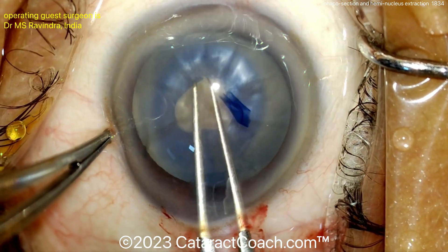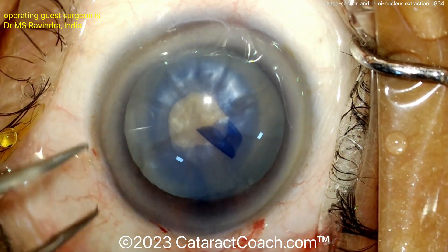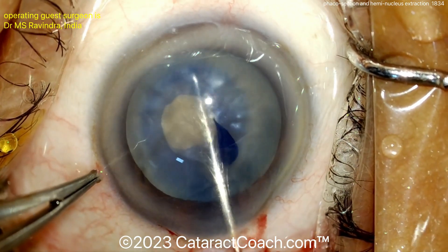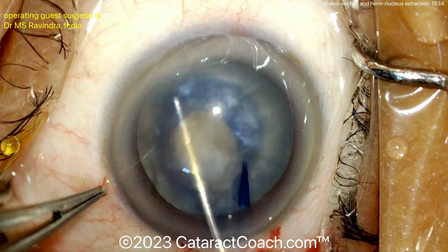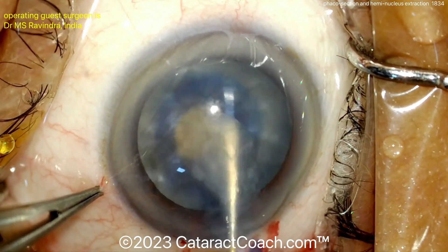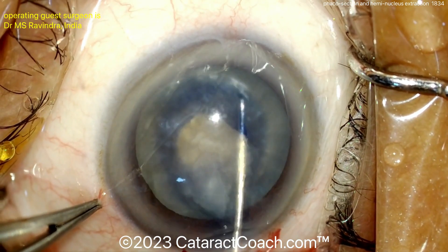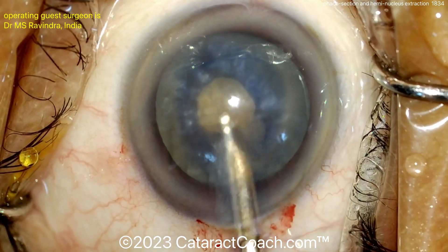At this point the incision's pretty wide — it's certainly going to cause some astigmatic flattening. Now enlarging that rexis bigger, now that the nucleus has been decompressed. Finishing that little loose tag, now rotating the nucleus. Remember there can be fluid trapped behind the nucleus — sort of rock it back and forth, rotate it around. That's actually important — you can see there is some intumescent fluid coming out a little bit.